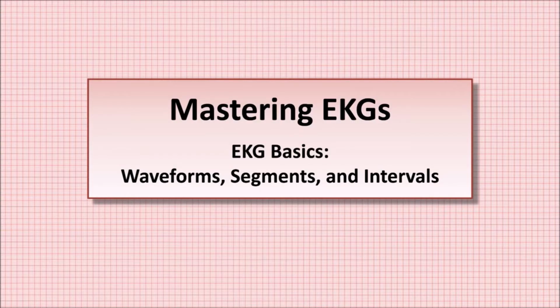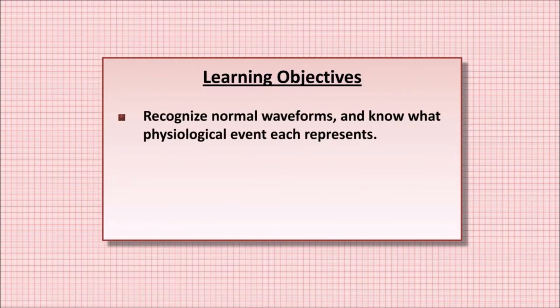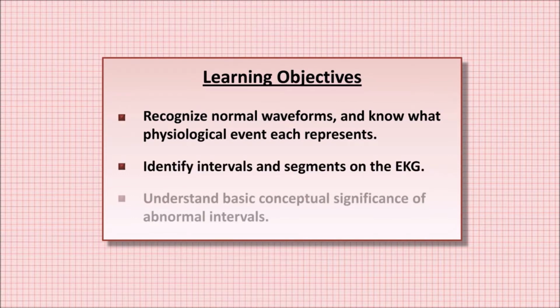Today's lecture on EKG basics will cover waveforms, segments, and intervals. The learning objectives are to recognize normal waveforms and know what physiological event each represents, to identify intervals and segments on the EKG, and to understand basic conceptual significance of abnormal intervals.